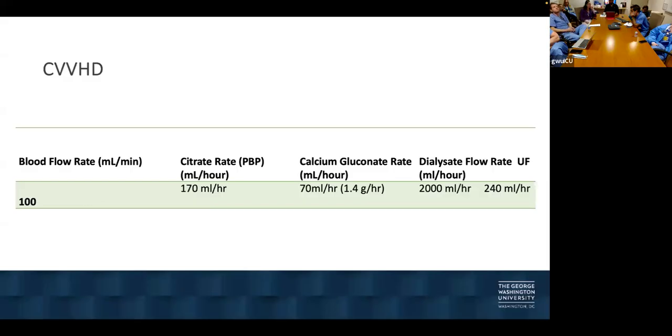Yes, they're taking too long. So that's why it's not an option. Then the citrate will prevent it from clotting at those rates. So we should be fine with this. That can be done. So this is like the chronic lady who's on CVVH for days and days and keeps clotting, sort of stable, but you need fluid off. I think we try to introduce it even for those folks, but for those hemodynamically stable, it should be more of a standard, to improve the longevity of this.